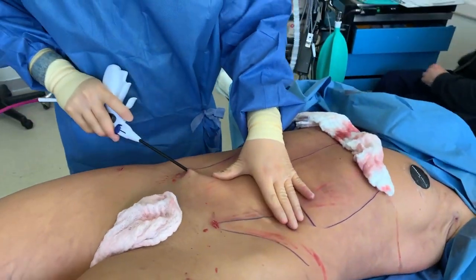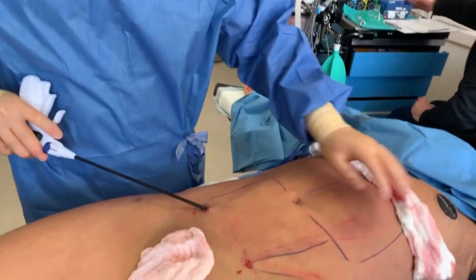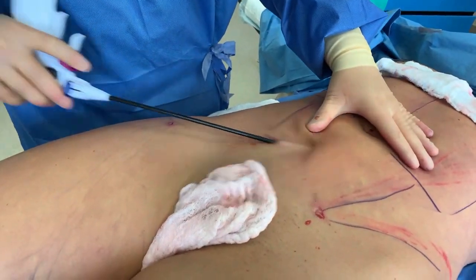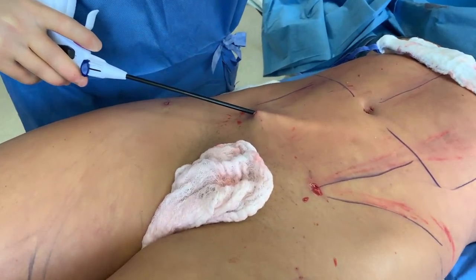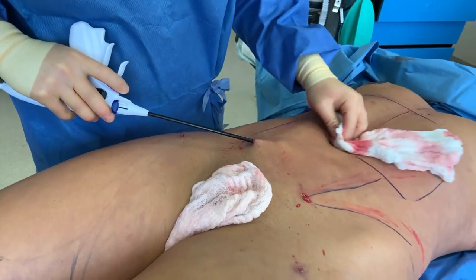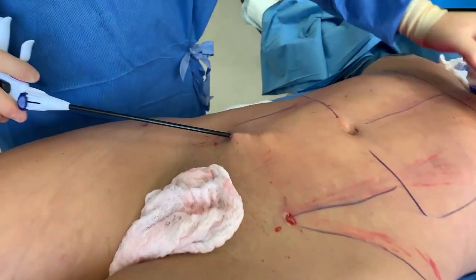Someone's asking what kind of cannula we're using — this is called Renuvian, you guys. This is the internal heating device. You can see that smoke, you can hear it — listen to the sizzling. That's the contraction. You've already removed fat, you've already created contour. Look at that smoke.